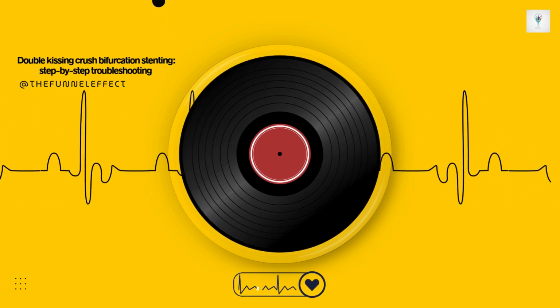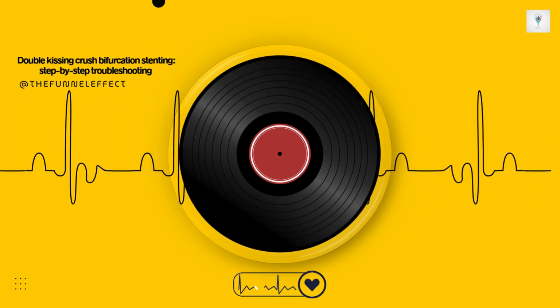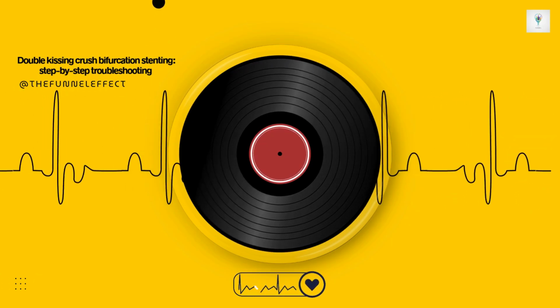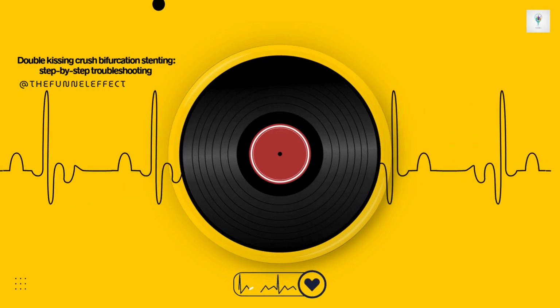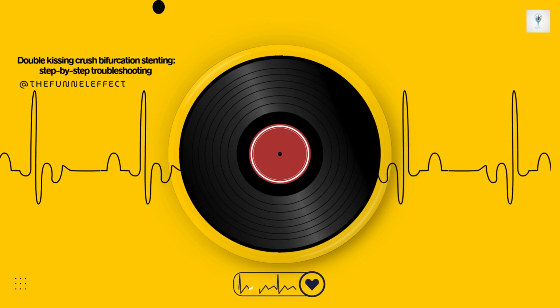And if this big MV stent now gets stuck, maybe catching on the crushed SB stent metal? If the MV stent won't advance smoothly, it usually means the path isn't clear enough. The standard fix is to go back in with a balloon appropriately sized for the MV and perform further dilation to ensure the stent delivery system can pass without issues.